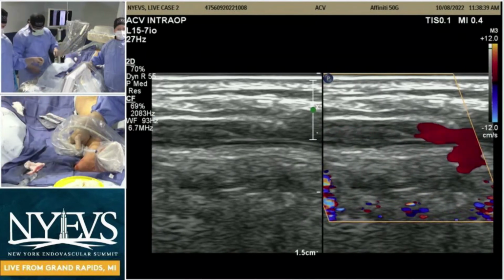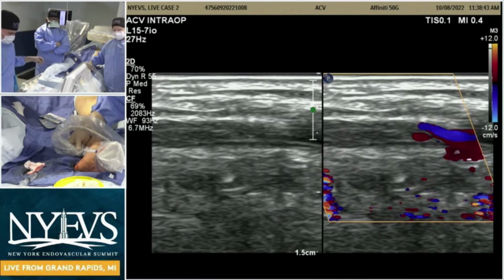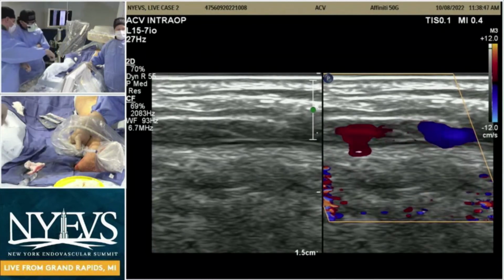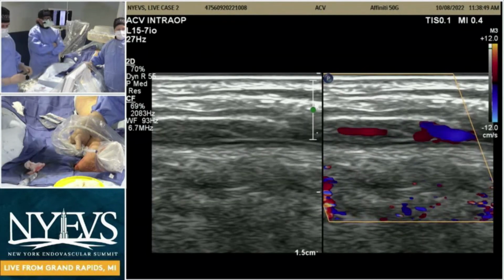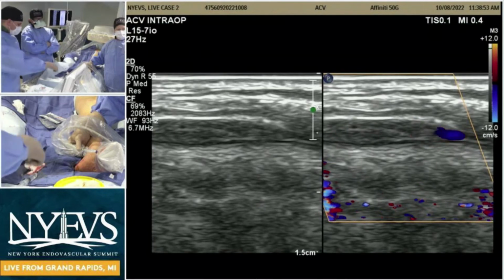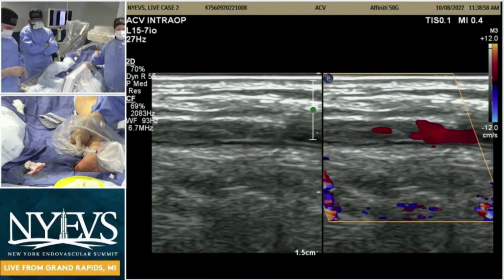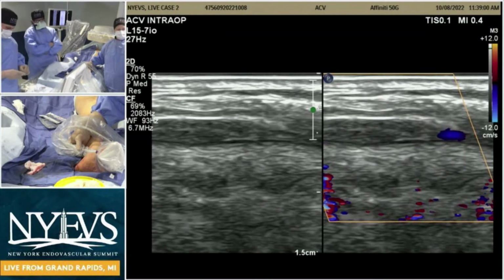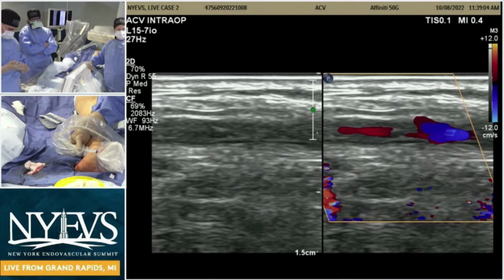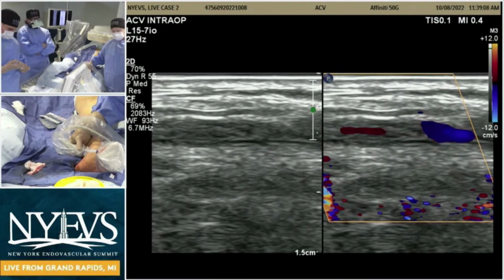No, I think that's a beautiful demonstration. And I know the case, I'm just going to ask the panel if they have any questions for you. I had a comment. One of the excellent choices to use inside a stent, when you mentioned your concern about how much debulking you're doing with passing a laser once or twice, one option is to use an Avenger device, and I think they just published their series on that, where it's image directed atherectomy, so you're seeing the stents, and you can actually do atherectomy avoiding the stent. That would be a reasonable option.